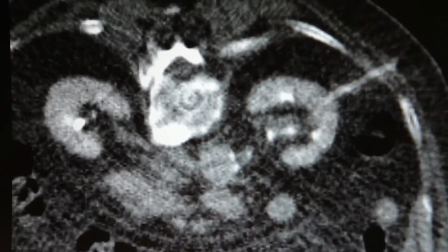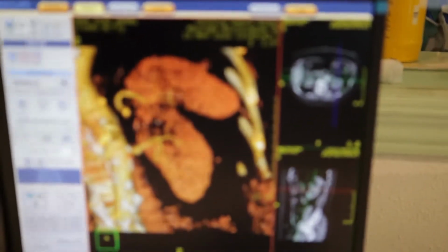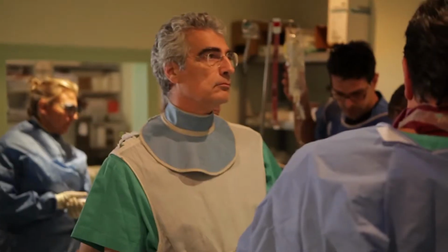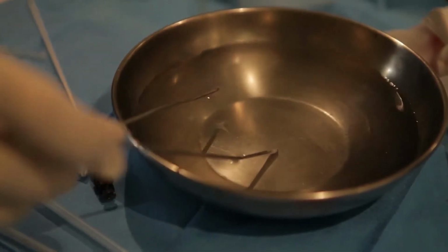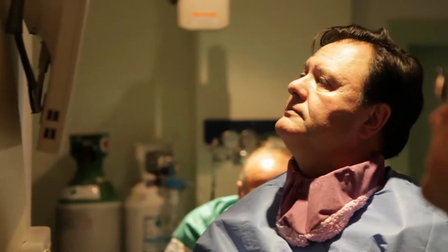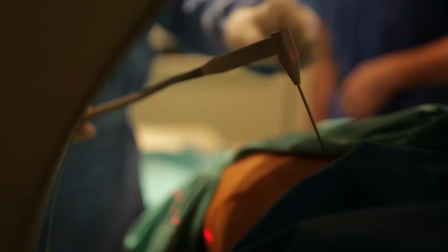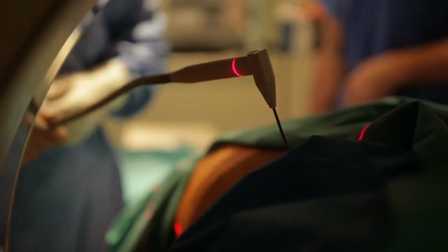but the patient, being very much concerned about the possibility of having a new cancer in the residual kidney, decided to ask us a second opinion in order to see if the kidney itself could have been spared while the cancer destroyed. The case will be done in the radiological set under CT guidance, and we will use a real-time CT in order to see what we are doing.